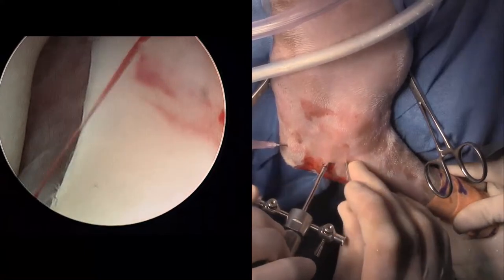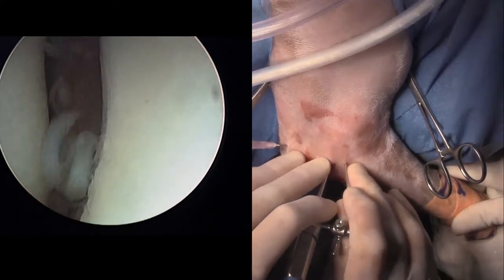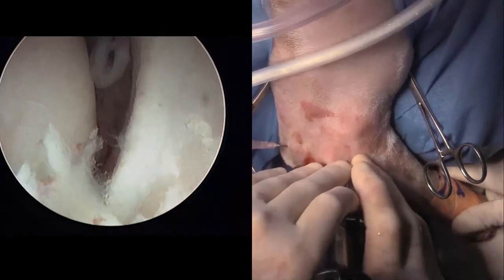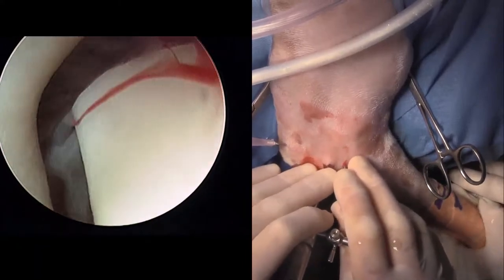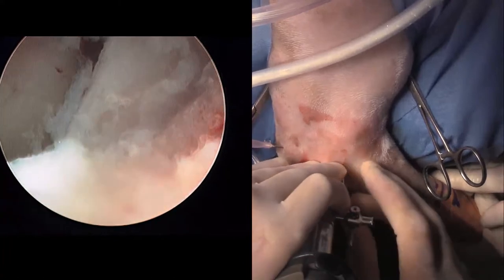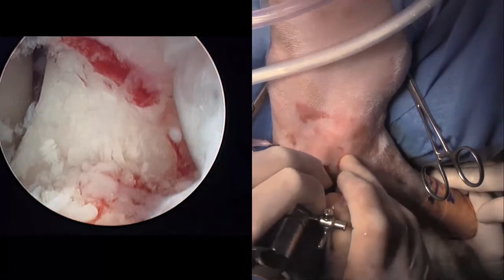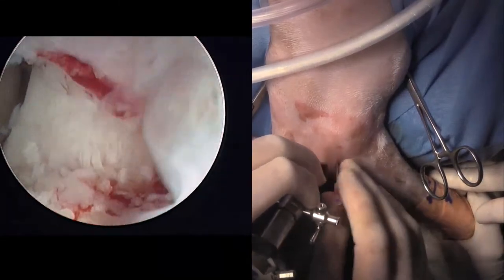All right, so now I'm going to get my other needle and try to find that. Can you internally rotate, externally rotate the arm? Okay, that's great, thanks. So that looks like it's actually radial head right there. Yes. So I'm just trying to find my needle on the inside of the joint.